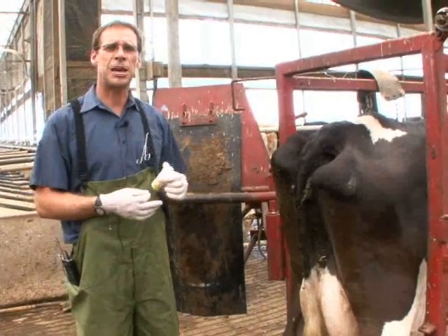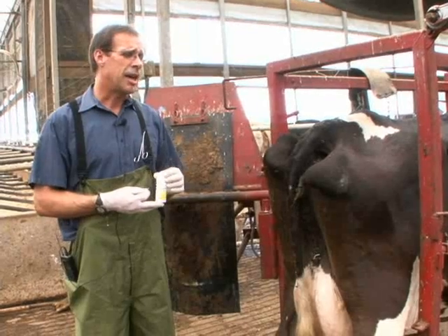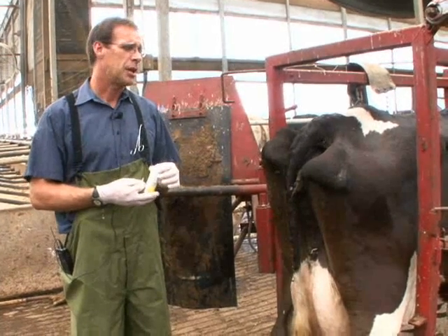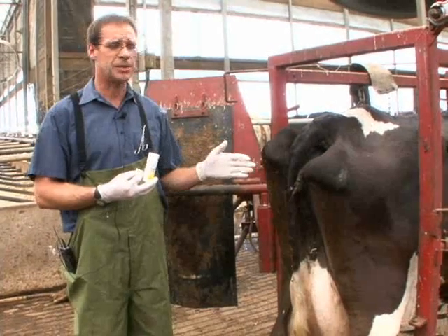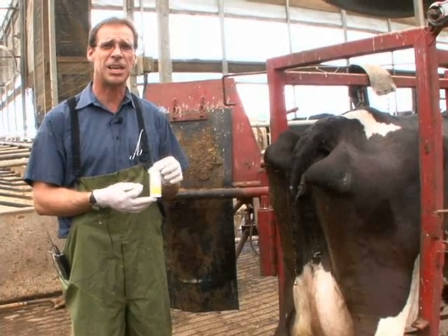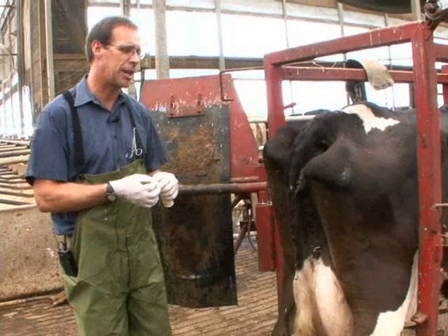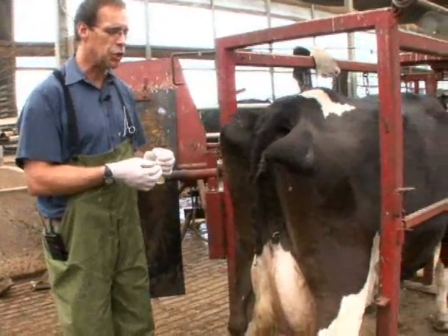When we're performing a physical exam on a cow, one of the first steps we like to do is collect urine. In order to collect urine from these cows, we have to do a local stimulation just below the vulva lips. Once we collect urine, we use these cow-side diagnostic tests to check for ketone bodies. I'm going to demonstrate the collection of urine by stimulating her to urinate.